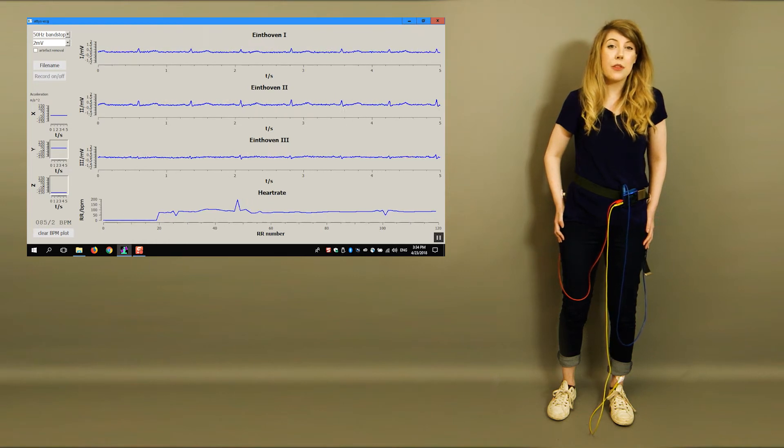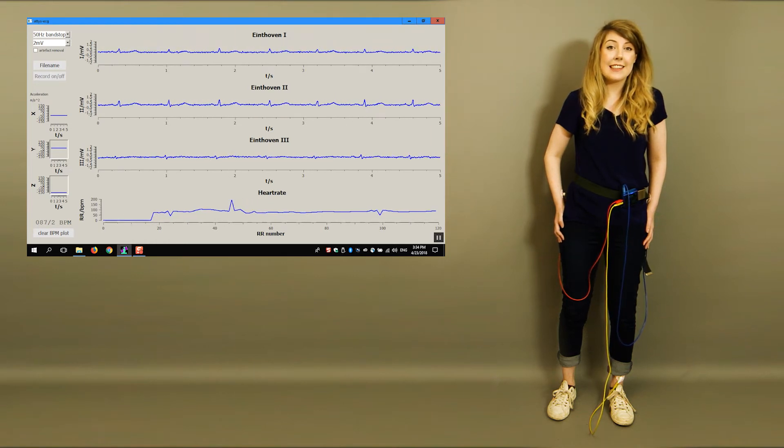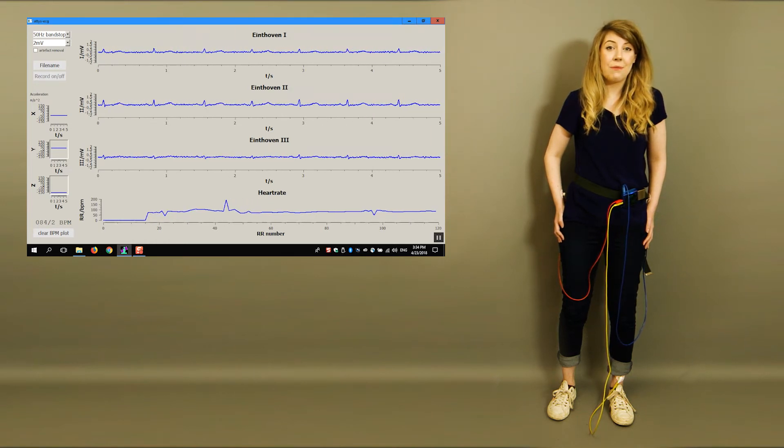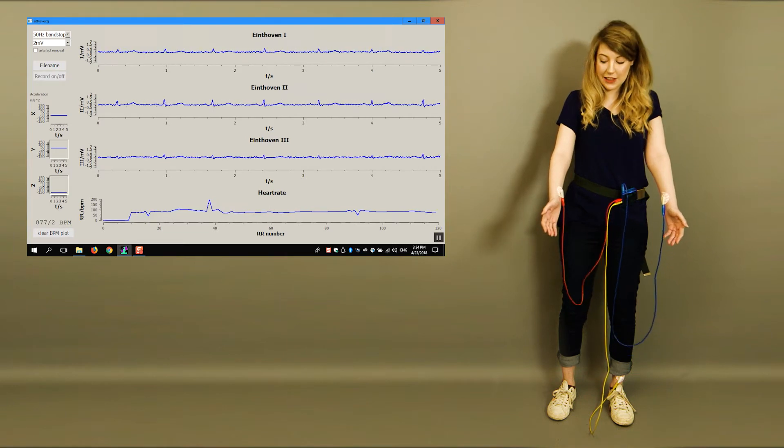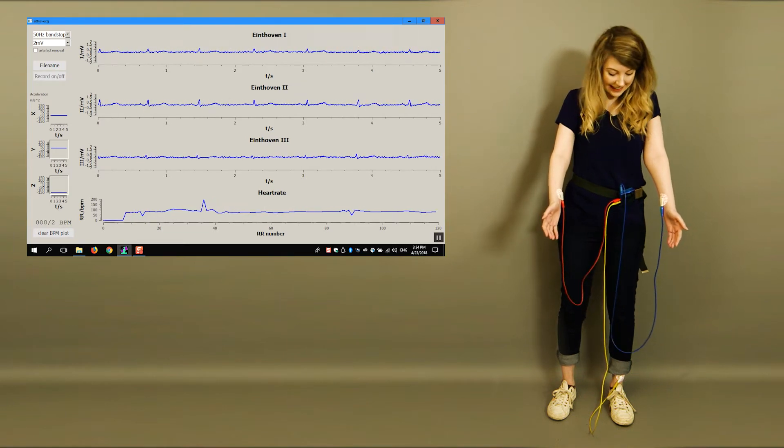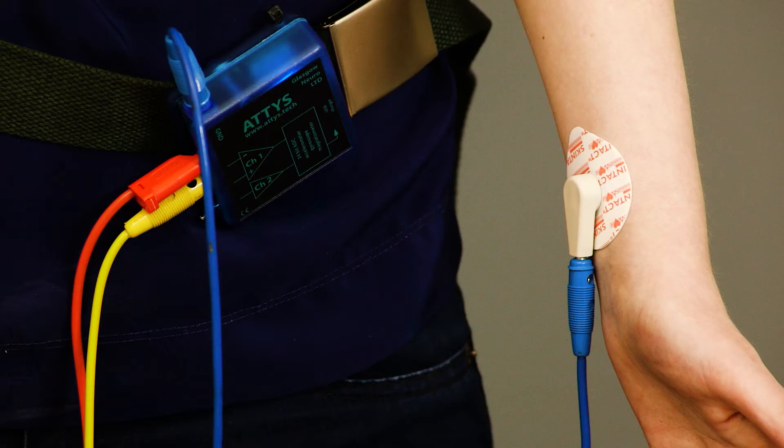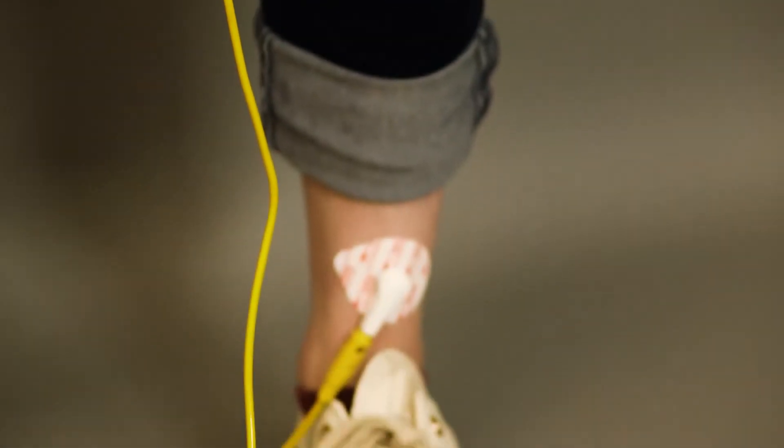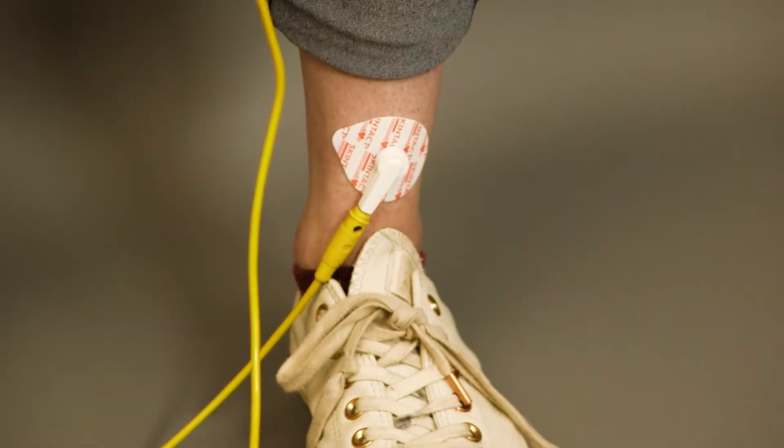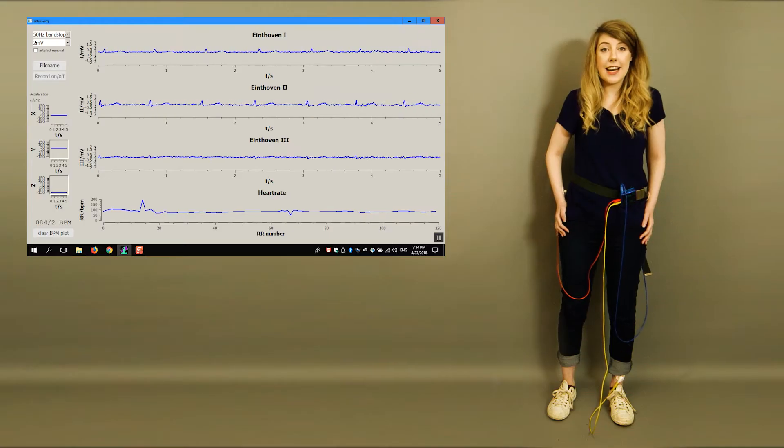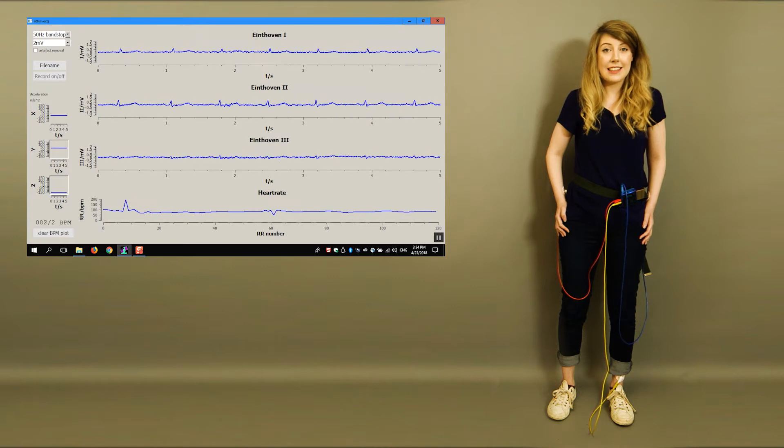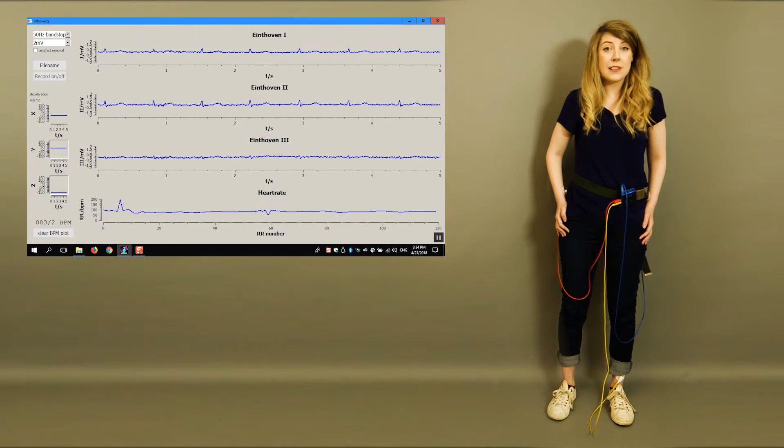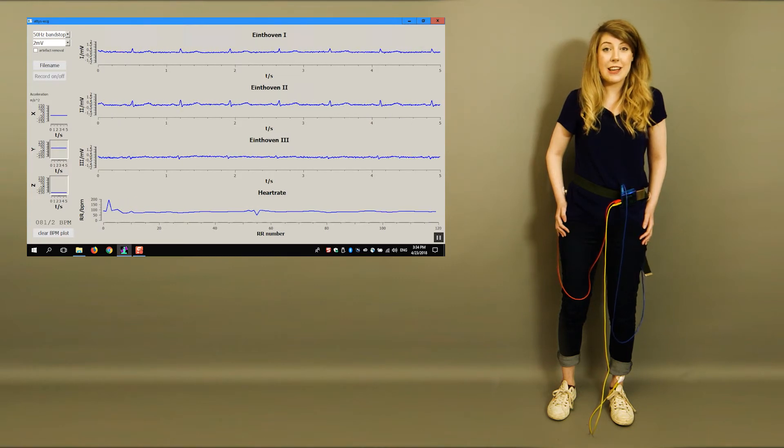Let's start with the worst case scenario. I have the electrodes on my wrists and ankle. As you can see, I use long cables to reach the electrodes. This gives us two artefacts. Muscle noise and the cables cause baseline shifts.